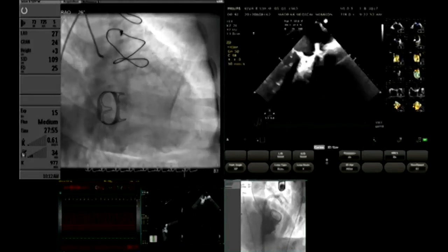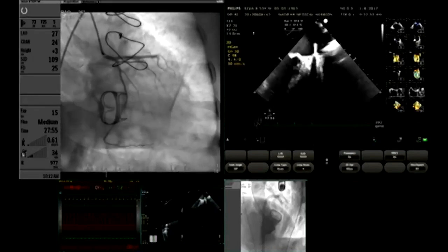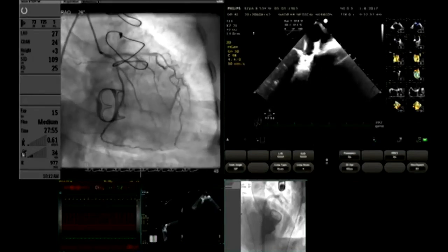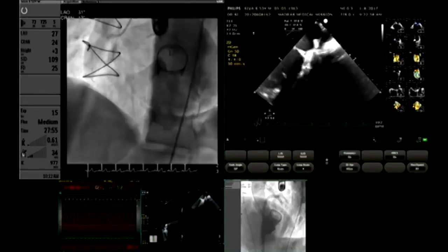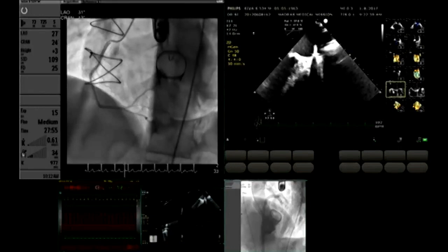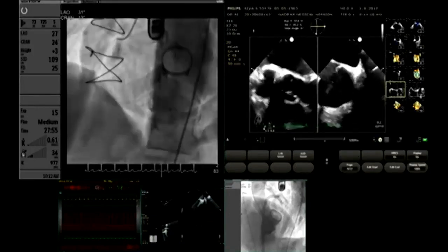As is customary, we have done a coronary angiogram and that shows normal coronaries.